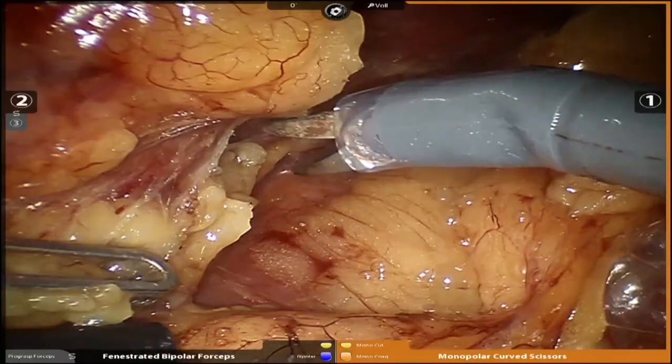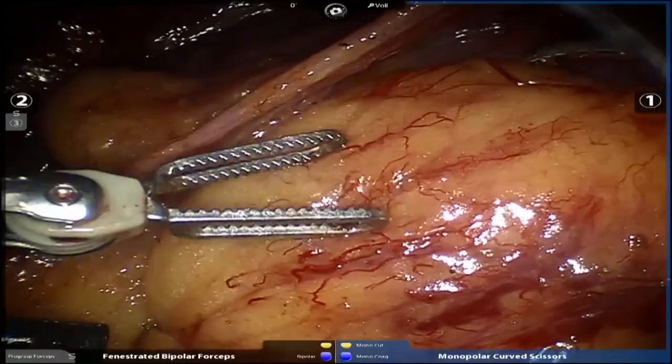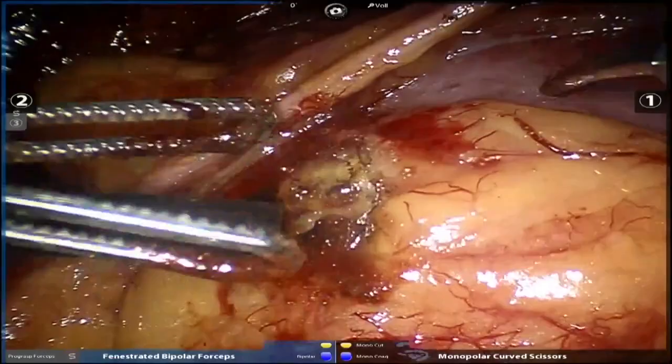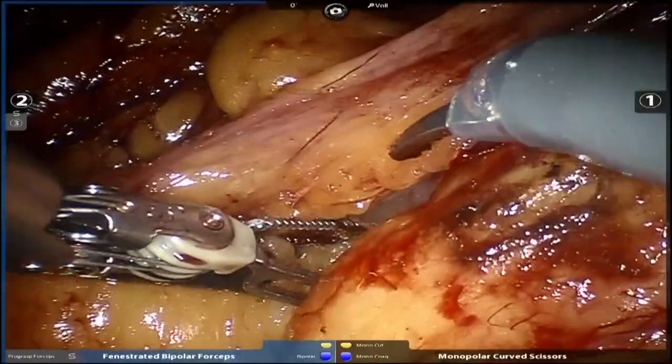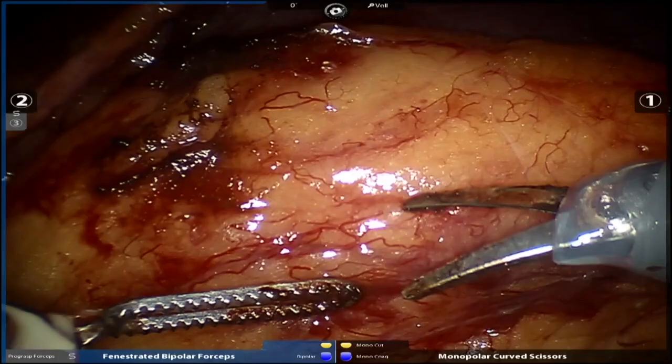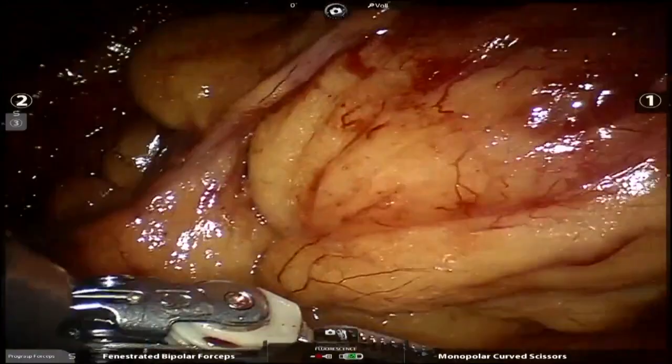I think what the retroperitoneal approach is really good for are patients who've had a lot of previous abdominal surgery. If they've had a lot of previous abdominal surgery, this is a good way to avoid having to deal with that. Many years ago, we did a prospective randomized study, not for partial but for nephrectomy, comparing trans versus retro. Most outcomes were the same, but that was just the point, as you said. If the patient has scars, has been operated on before, trans, then you better go retro and vice versa. Okay. All right, so we're getting around the tumor.